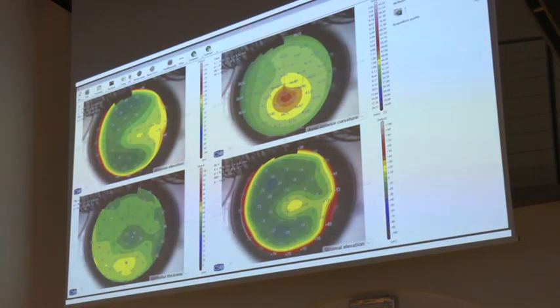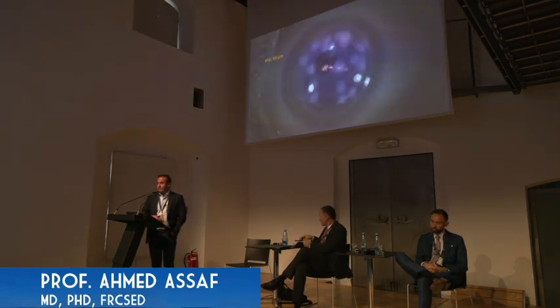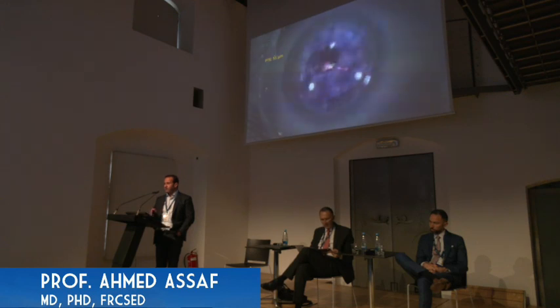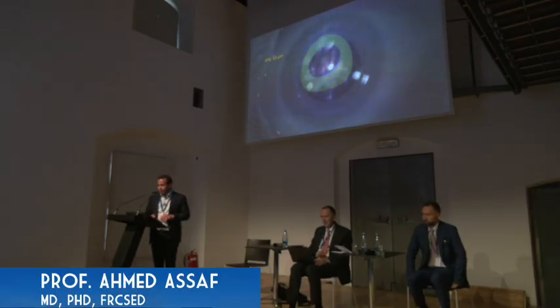I'm not sure if the laser pointer is working. As you can see, the epithelium is thinner in the center and thicker in the periphery, and the difference is around 10 microns. So if we are going to do the PTK 55 microns before the topography-guided PRK, we are ablating the central part of the epithelium first, and after 50 or 55 microns, we still have an annulus of untreated epithelium. There is still an annulus of epithelium covering the stroma, and our target is to regularize the anterior surface of the stroma.